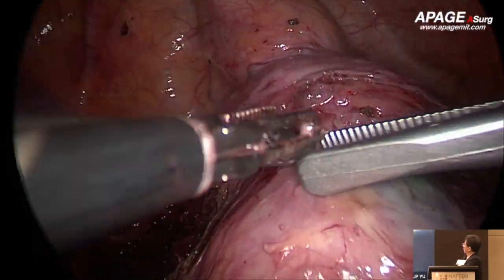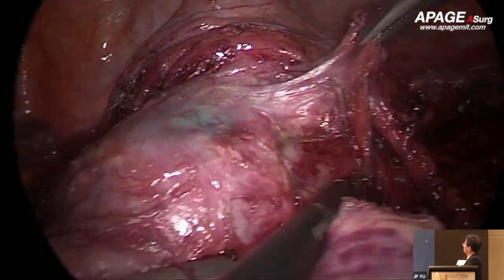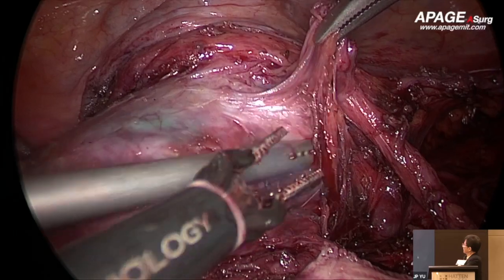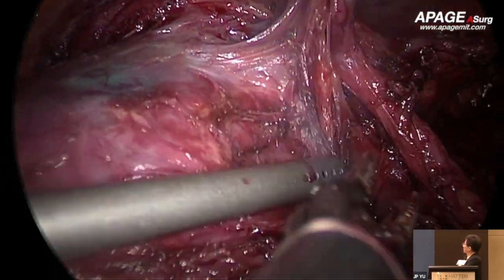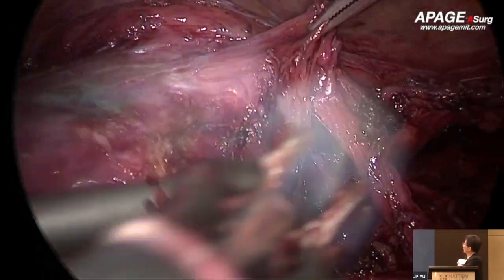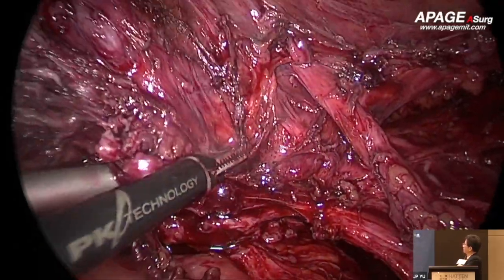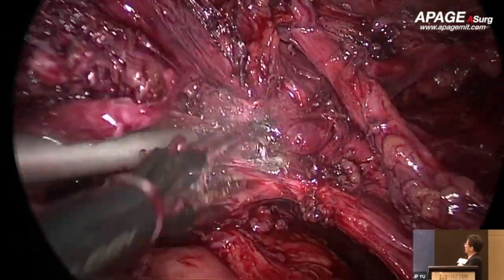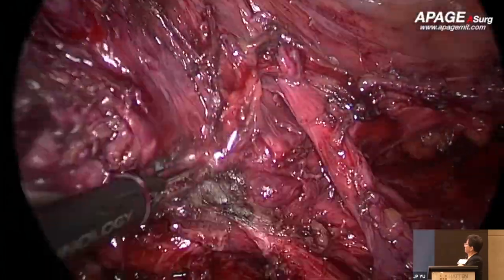Okay, so here we can find our uterine manipulator just here. We take about 2 centimeters away from the fornix. Here is some small vascular vessel. That is the so-called vesicovaginal branch of the vaginal artery. Also we just coagulate it and dissect it away.